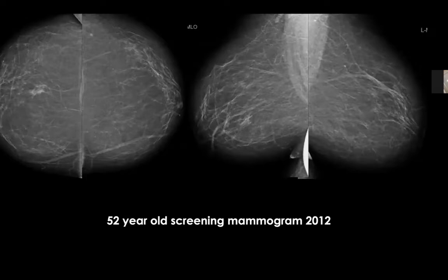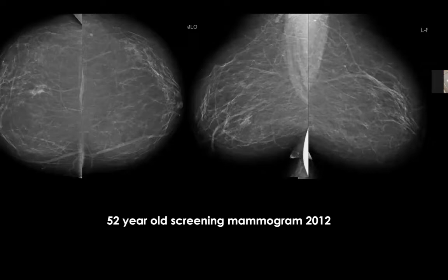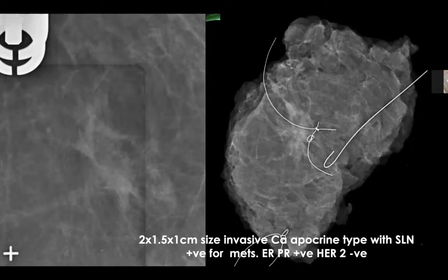Now a focal asymmetry — asymmetry can be in one view or two views; when in two views it is more focal. Always compare right and left breast to see what's different. There is density on the right breast in the mid portion. When you find it, work it up — do a spot compression or magnification view. We do spot compression; it doesn't go away. If it were normal breast tissue, it should disappear. Now we give it BIRADS 4A, though 4B would also be reasonable. Ultimately, you have said the lesion needs biopsy. We biopsied it and found invasive cancer of apocrine type.